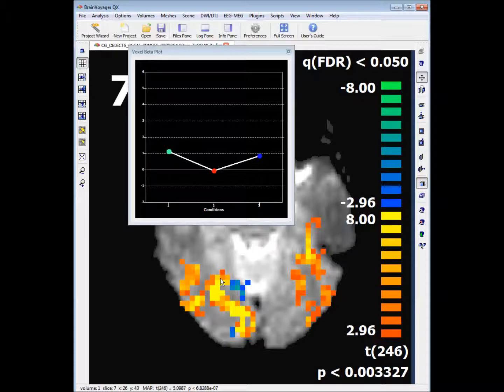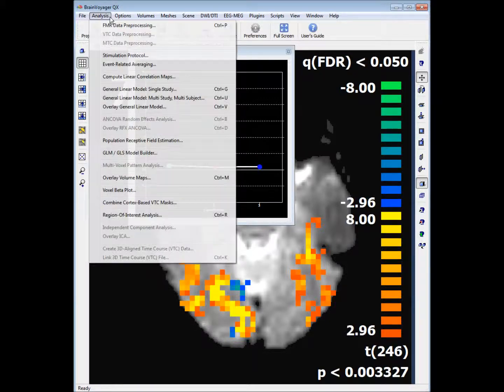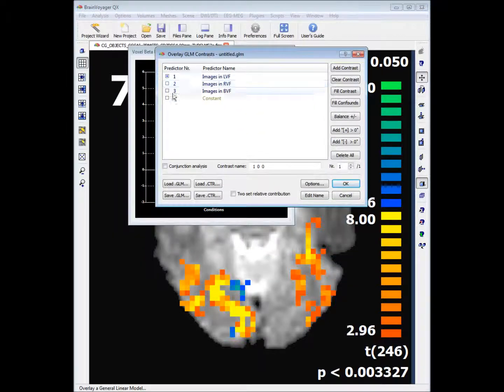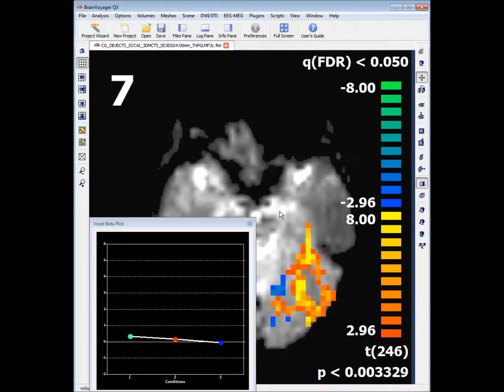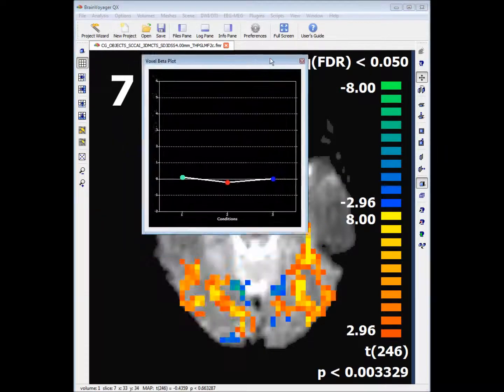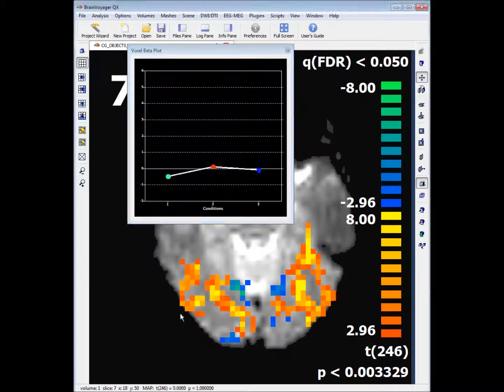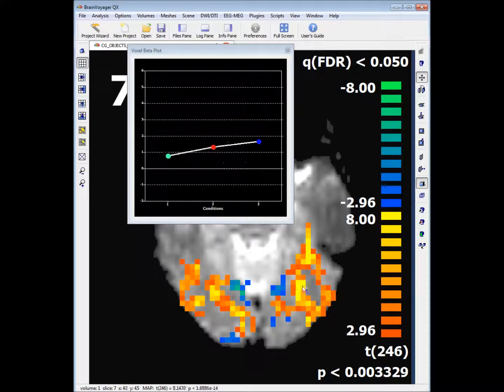We can also look at how much two predictors explain the variance in the time course for each voxel by putting check marks in two other predictors and clicking OK. What you'll see is there are a lot of significant regions of interest in the right visual field and the left visual field for explaining both.